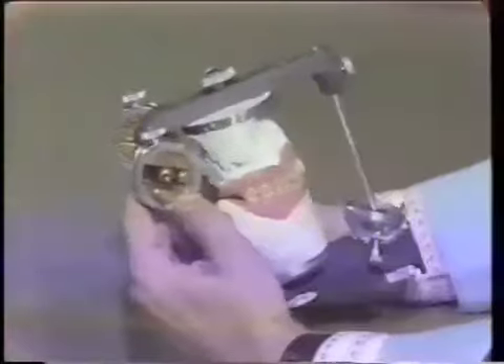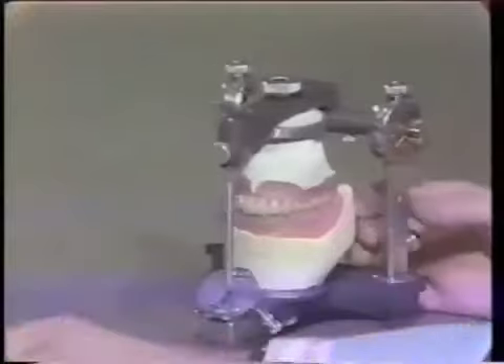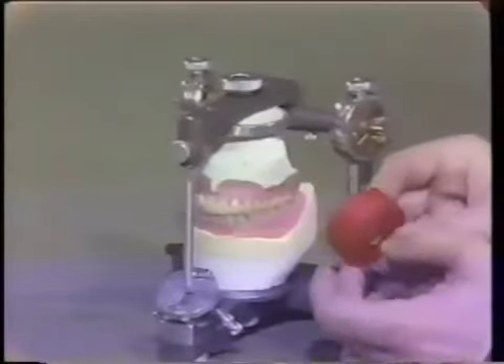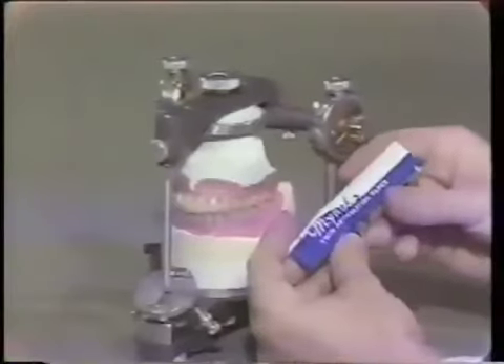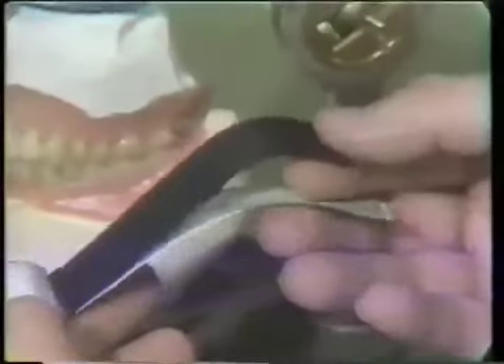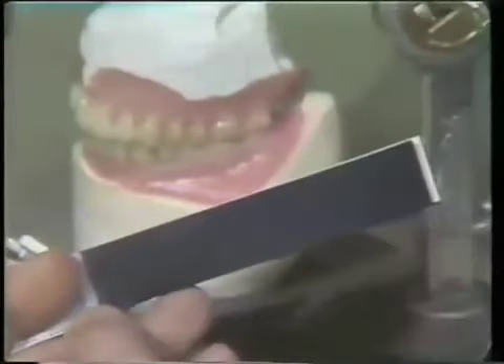In selective grinding, we can use various methods of marking the teeth. One is a typewriter ribbon material — it's very thin silk impregnated with ink. It comes in black and red; we have red and will make small pieces available. Another material you are probably accustomed to using is the Millar type of articulating paper. It's blue, but unfortunately a little thicker, and the thicker the paper gets, the more inaccuracies we have when we adjust the occlusion.